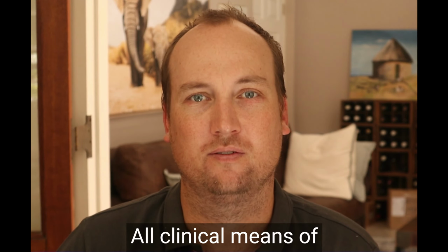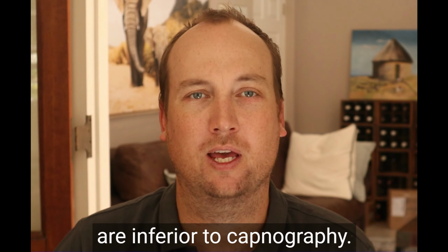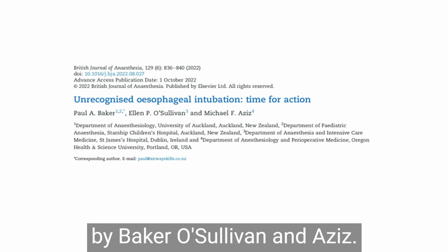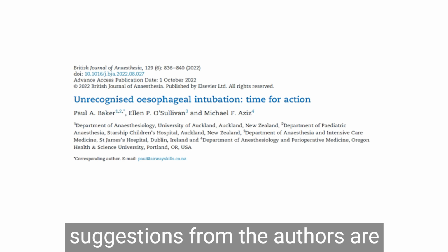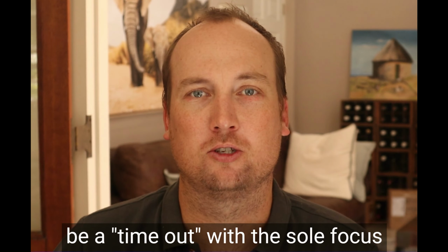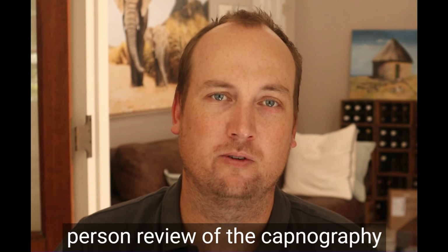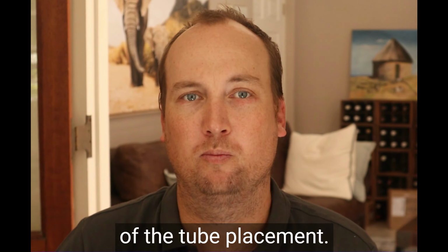All clinical means of assessing correct placement of the endotracheal tube are inferior to capnography. This is a recent article published in the British Journal of Anaesthesia on this topic by Baker, O'Sullivan, and Aziz. In this article, the suggestions from the authors are that post-intubation, there should be a timeout with the sole focus on confirming the placement of the endotracheal tube. This should be done by a two-person review of the capnography waveform for confirmation of the tube placement.